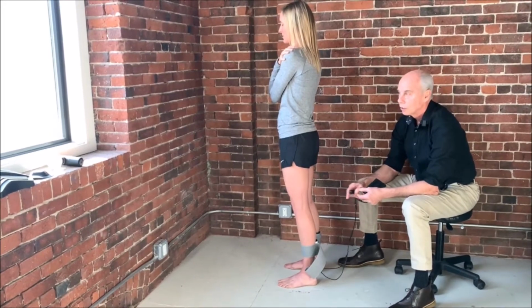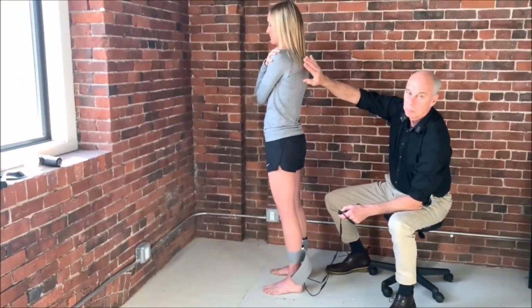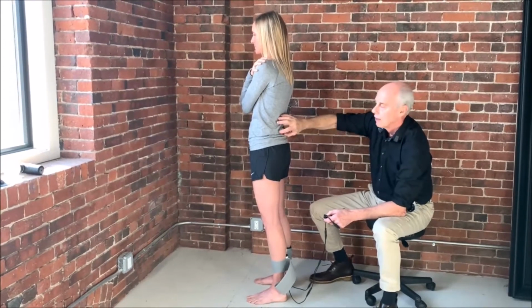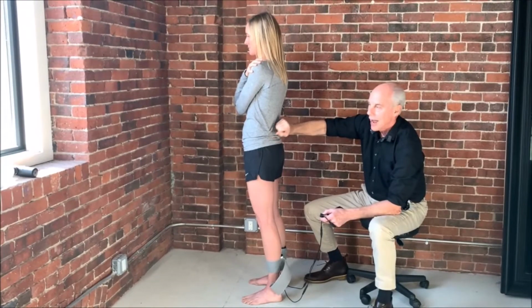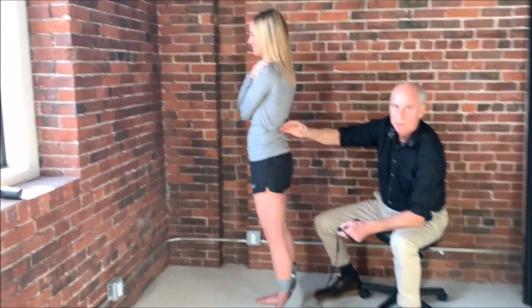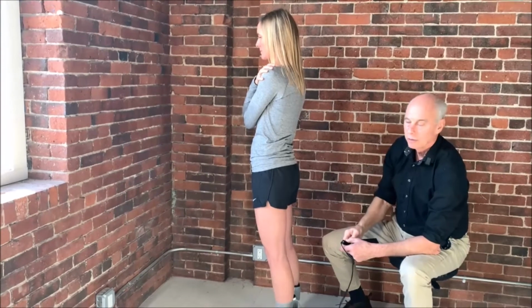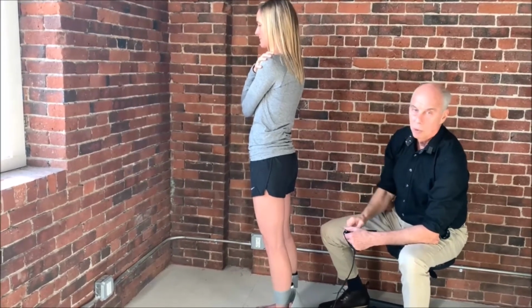You can also do this if you treat someone with a frozen shoulder, since spindles regulate tension. You can just put the motors over their shoulder for a few minutes before you work on it, or any muscle that's really tight before you work on it, because if a muscle is seizing in response to pain, spindles are tightening, and that can cause joint dysfunction, it can cause things to lock up. If you temporarily suppress that information, you can produce a break in the pain cycle, which is really helpful. But I just use it primarily as a diagnostic tool and then for mobilizing stiff joints.